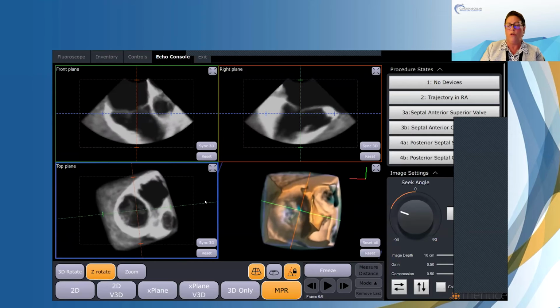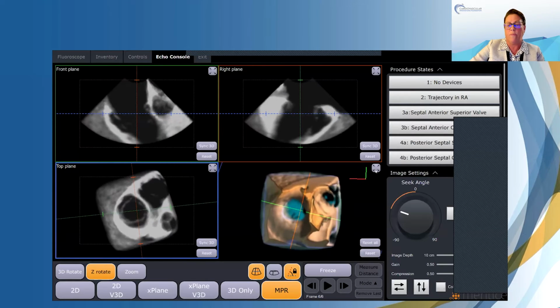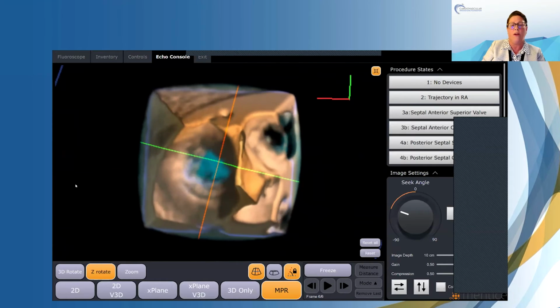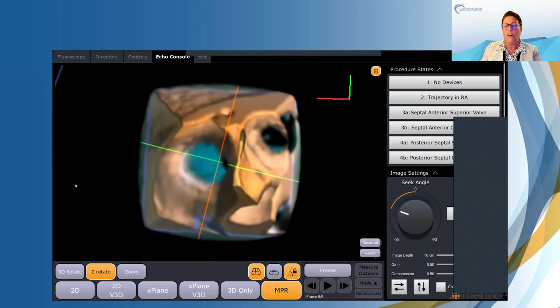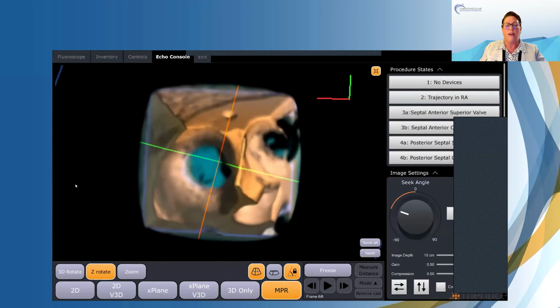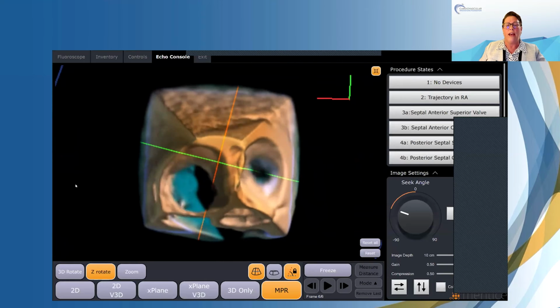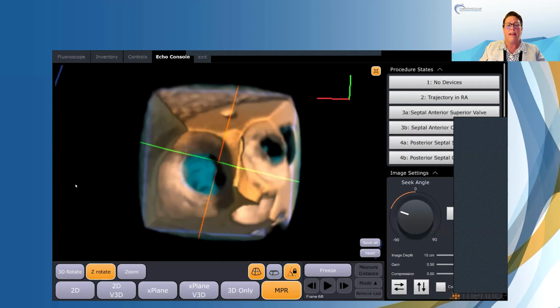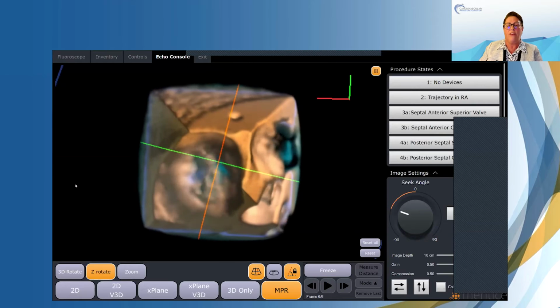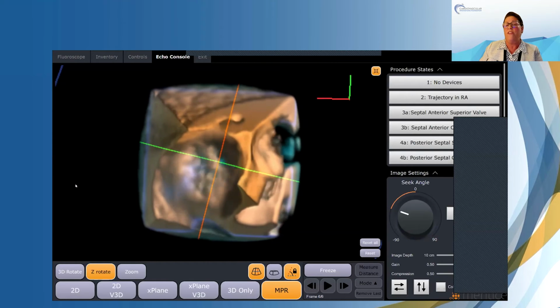And this might be more what you're used to looking at. The catheter is entering from up here on the top left, because all I did was rotate Z. The catheter is in the same place. All we are now doing is looking at this image rotated. Again, if I advance or retract or clock or counterclock, I can adjust these planes. These are the exact same movements the interventionist would use to move the device.